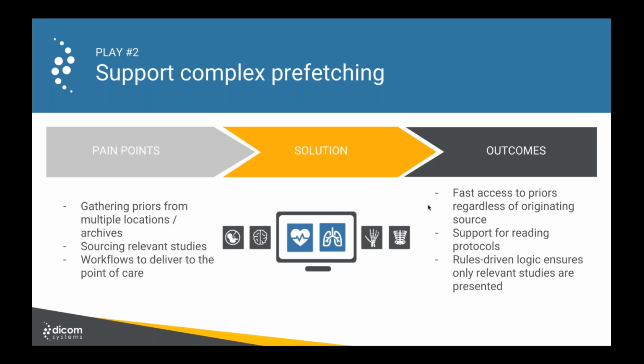Sure. So Foundation made a decision, I want to say 5 years back, that we wanted to keep and store as many images as we could possibly. Now, not every client is comfortable with that. Some have specific rules about deletion and retention. But where possible, we're trying to store as many of those images as possible.